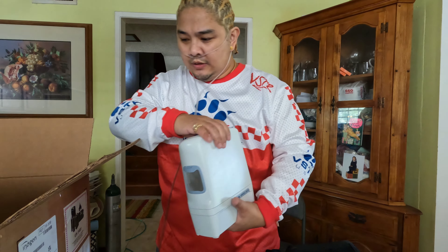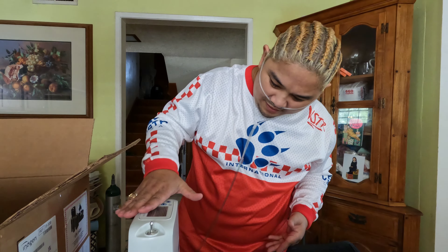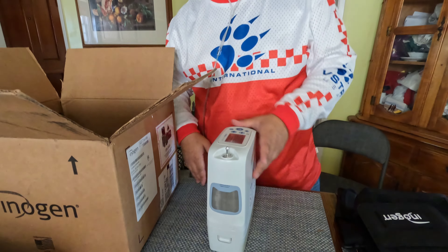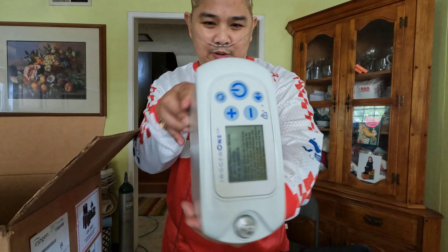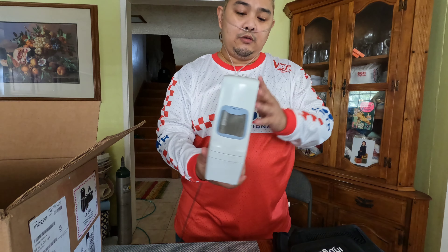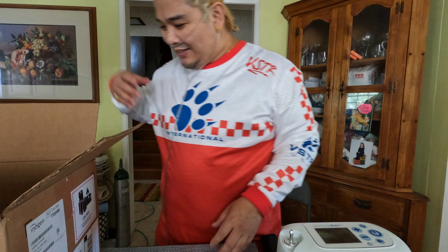We also have the Inogen concentrator. This thing stands about this tall. And we have here the Inogen 1 — if you can see, it comes like this. It says Inogen 1 G5.